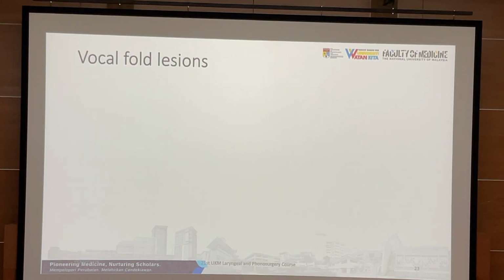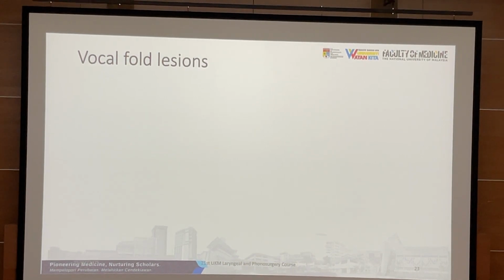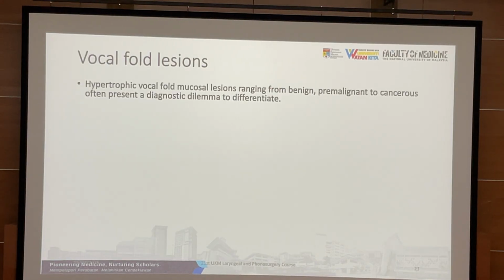Also, why is it important for you to see the vessels? Because the vessel pattern may tell you what type of lesion you are dealing with. Is it benign? Is it pre-malignant or is it malignant? So now, just a little bit about vocal fold lesions.